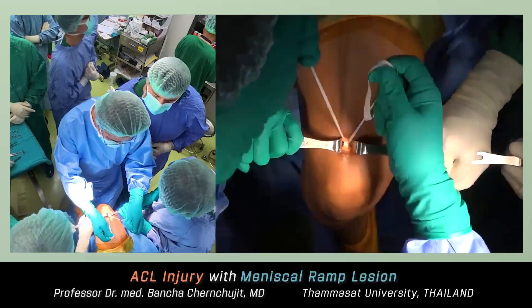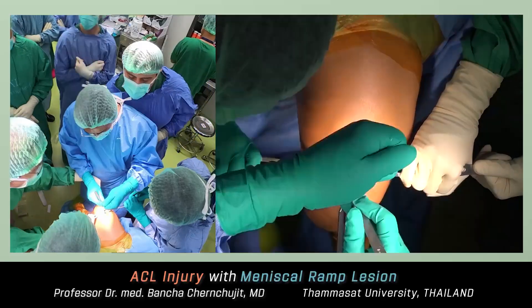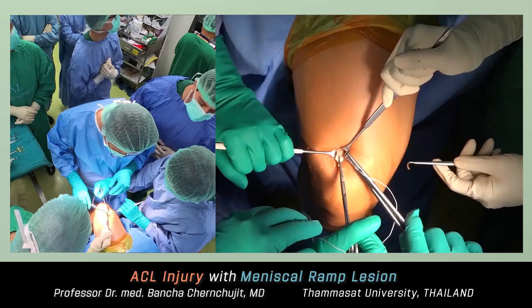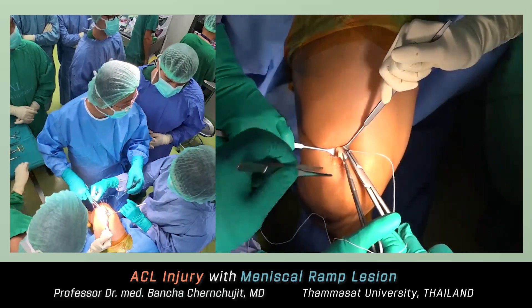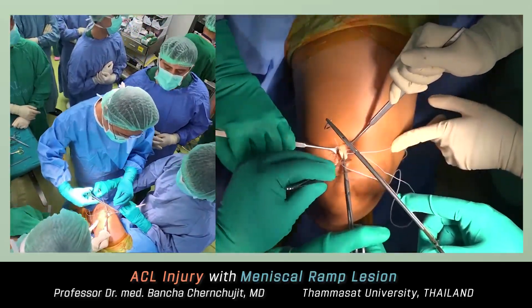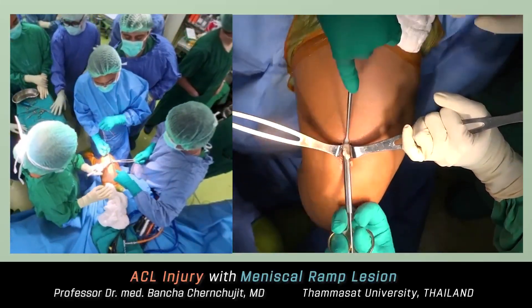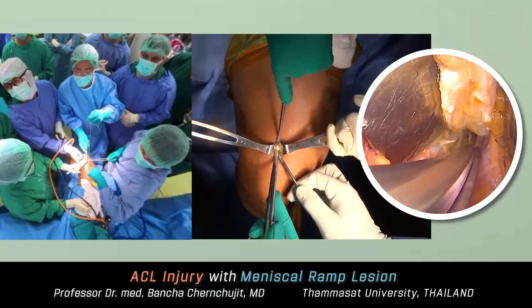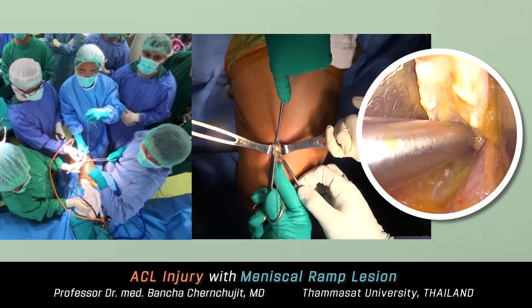Move the cord tape up and down a few times to strip the tendon tissue. If you incise the tendon tissue too distal, the quadriceps and rectus femoris will blend together — go more proximal and they can be easily separated. Use Metzenbaum scissors to separate the undersurface. You should see fat tissue and be able to pass the Metzenbaum freely. On the scope view, confirm free passage to avoid premature cutting.